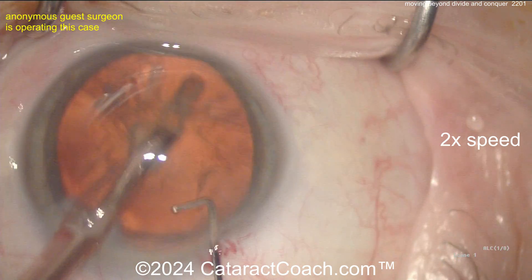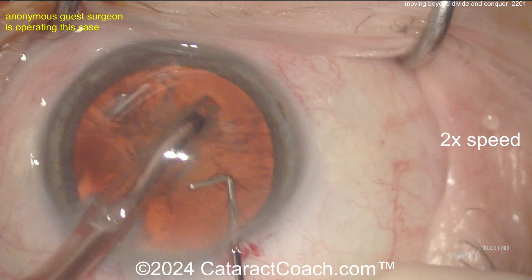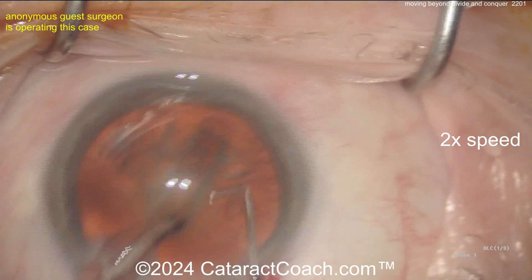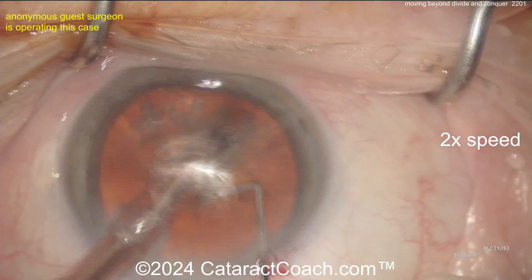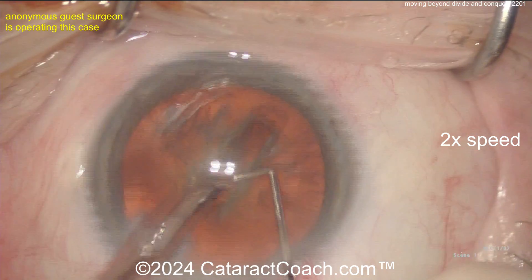Advance your skills. Here it looks like a left-handed surgeon doing a groove down the middle. You can tell a good groove where the surgeon is keeping the eye in primary and making the groove a little deeper in the center and a little shallower towards the periphery — that looks pretty good. Widening up the groove here — I like this.